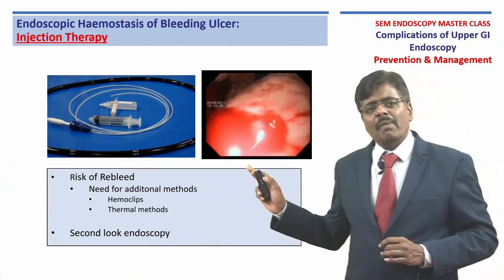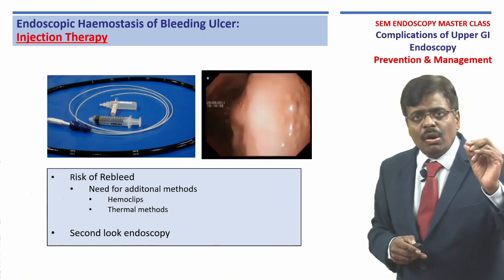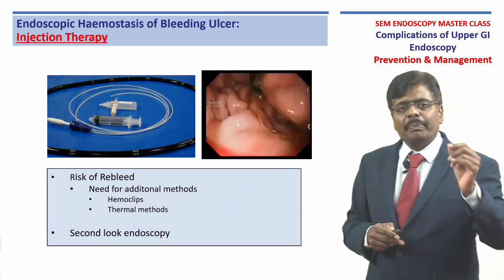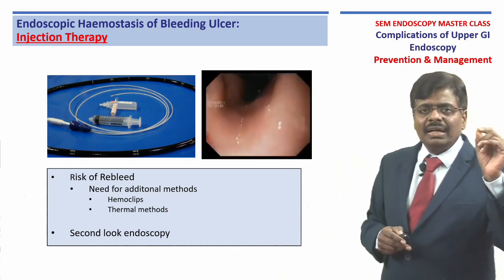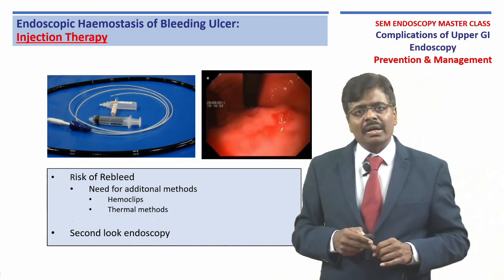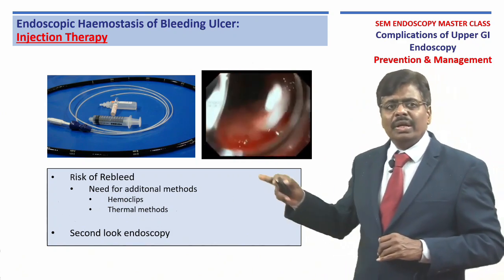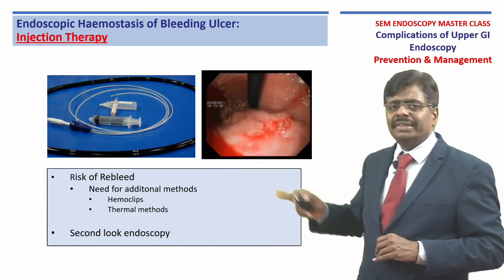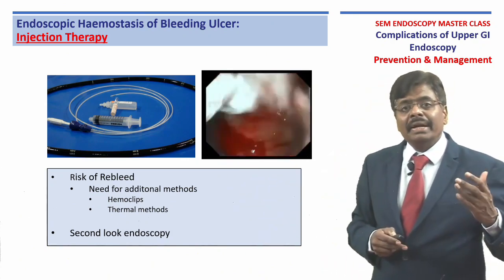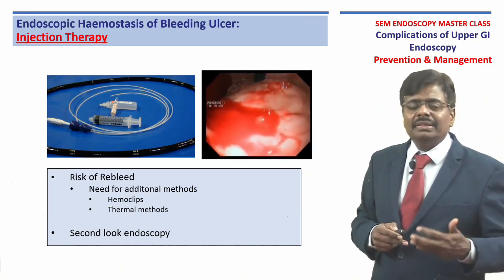Injection is one of the commonest procedures you may consider as a beginner, especially when you have a small oozing ulcer, either in the pre-pyloric region or a duodenal ulcer with oozing, like Forrest classification 1B. That may be the one where you can use 1 in 10,000 dilute adrenaline in 4-quadrant injection, but in spite of that it might continue to bleed. In those situations, unless you have experience, it is very difficult.